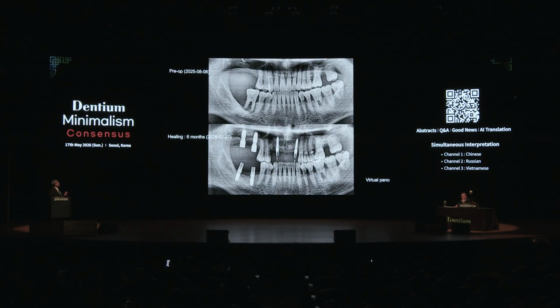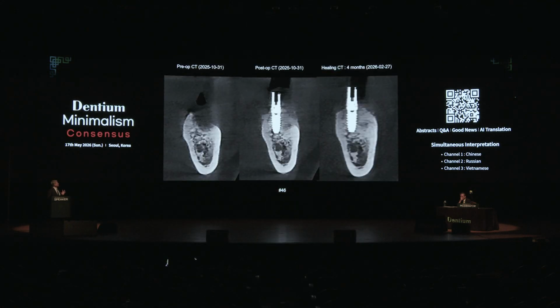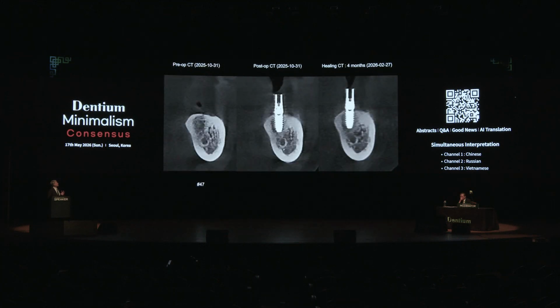And this is another case in the lower mandibular side. Especially on this side after extraction, there was severe bone loss vertically and horizontally. So after extraction, some months later when you place the implant, there is not enough bone. So we graft the collagenated bone and the collagen graft together. During the follow-ups, the bone formed very well. This is a second molar.